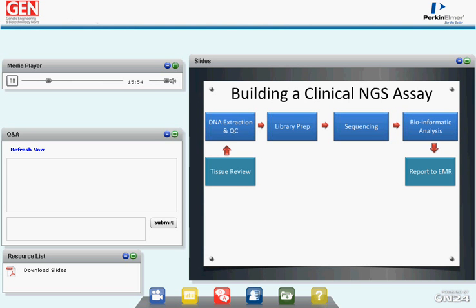On the sequencing side, this is now taking those fragments that have been enriched and turning them into digital data, the process of sequencing. And this is really what revolutionized this field. These new sequencers, these machines are able to sequence millions to billions of individual DNA molecules, resulting in a very large amount of data, which is where the bioinformatic analysis comes in.